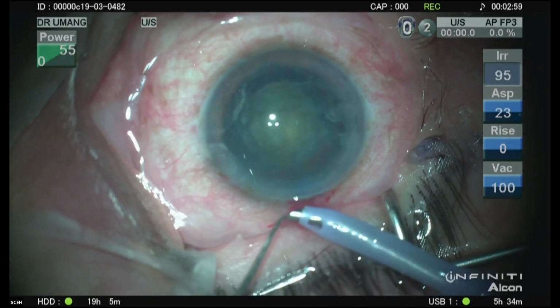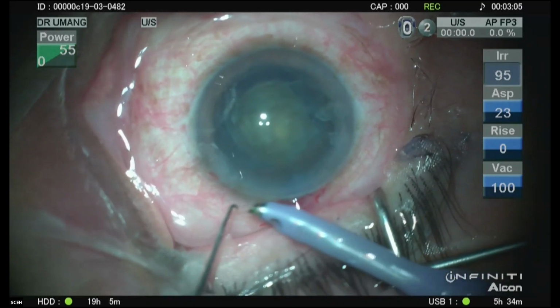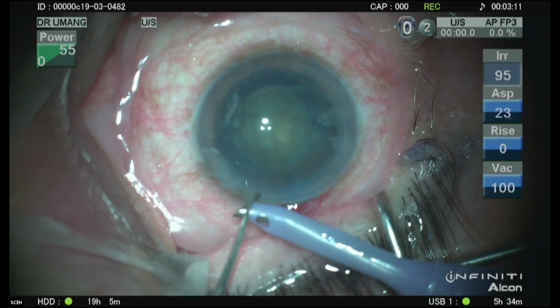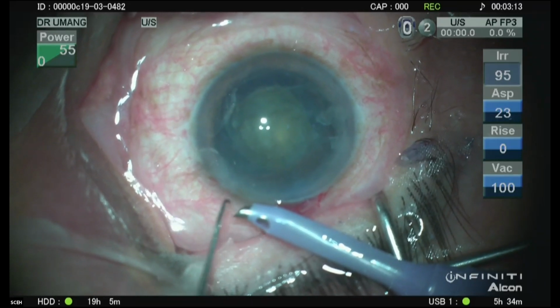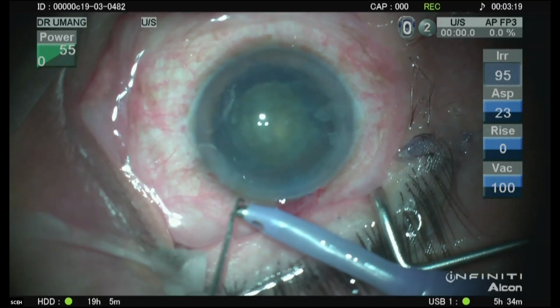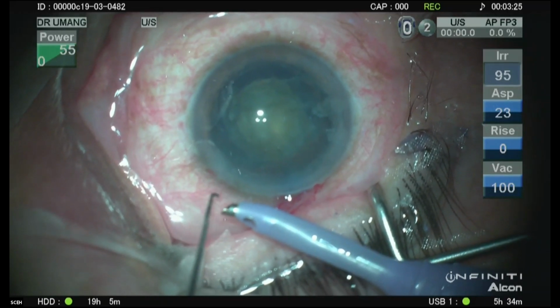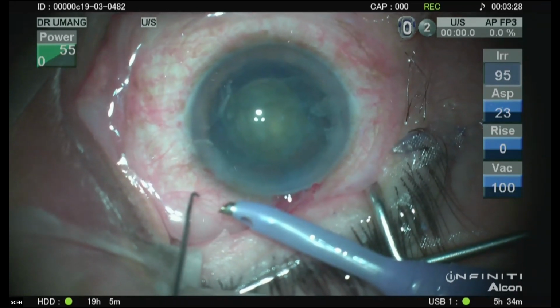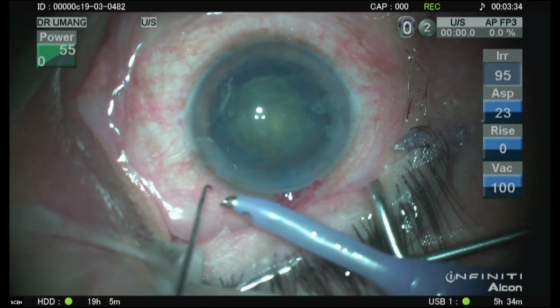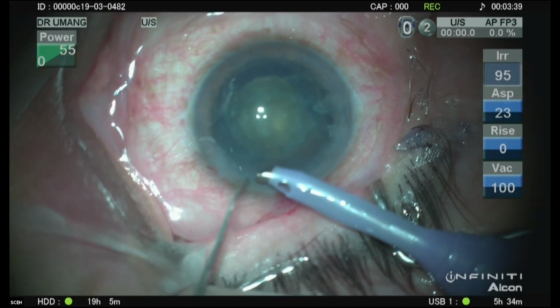45-degree tip. A 45-degree tip has very good cutting, but you need to go inside the nucleus much more to generate vacuum, because it will get occluded only when all of this has gone in. So a 45-degree tip is good for cutting, especially in harder cataracts, but it will take more time to generate vacuum. A 30-degree tip, on the other hand, will be easier on generating vacuum. A 15-degree tip would generate vacuum very well, but cutting action would not be that good. So that is how you choose.